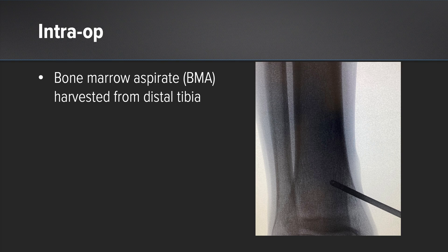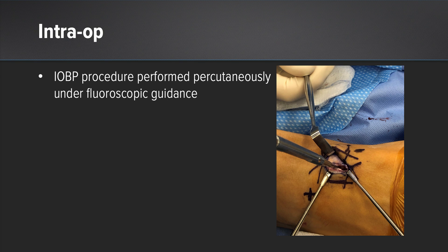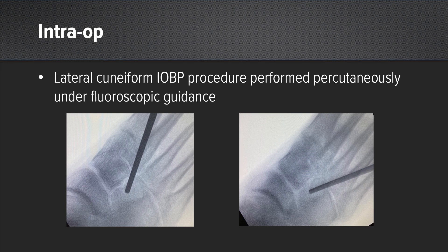We then harvested our bone marrow from the distal tibia and sent this off for processing. We localized the lateral cuneiform under fluoroscopy in order to do the intraosseous bioplasty under a percutaneous technique, indicated with the X mark on the dorsum of the patient's foot. You can see under different angles of fluoroscopy how we localized within the lateral cuneiform, placed the guide wire into the cuneiform and overdrilled this with a cannulated drill. We then inserted our syringe and injected our IOBP material into the lateral cuneiform to help promote more reliable healing.